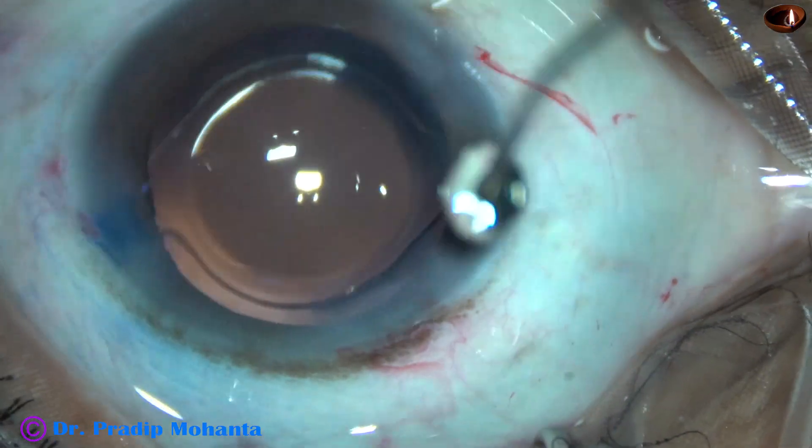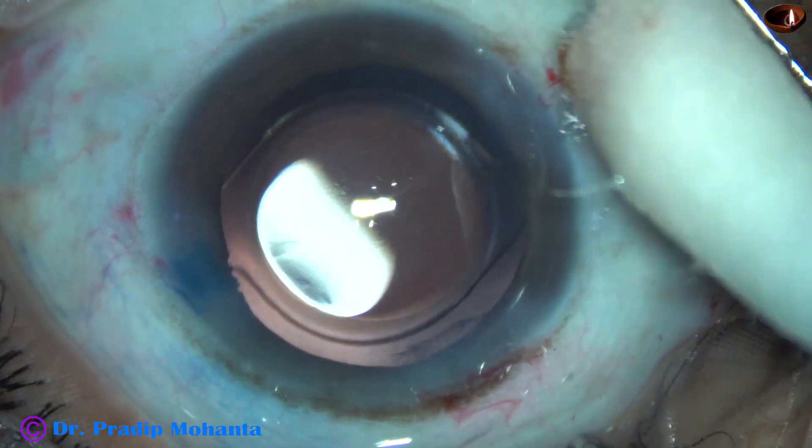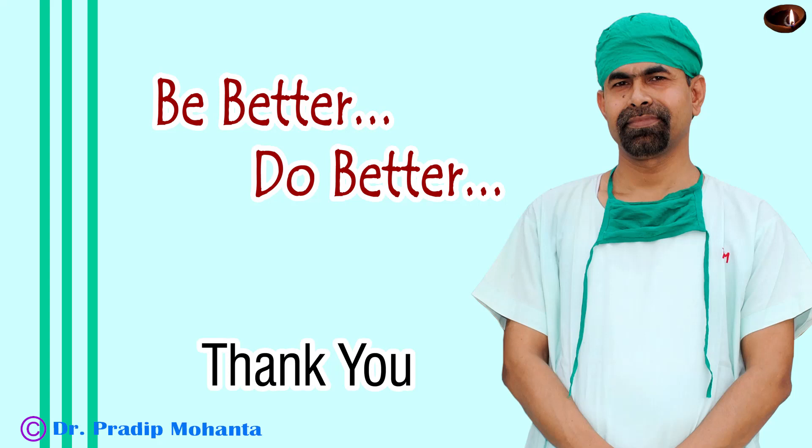Now the integrity of all the wounds are checked. Few drops of moxifloxacin is applied over the cornea, and the case is concluded. Thank you very much for your attention. Hope this video will help you in developing your surgical skills. Be a great surgeon and serve your patients with love, respect, empathy, and great surgical competence.